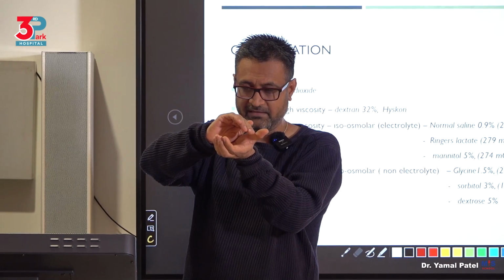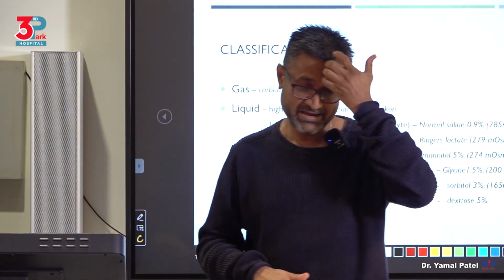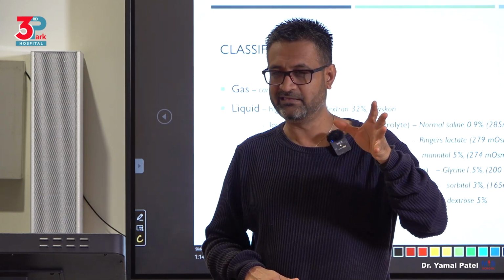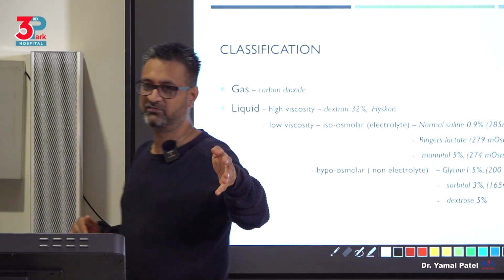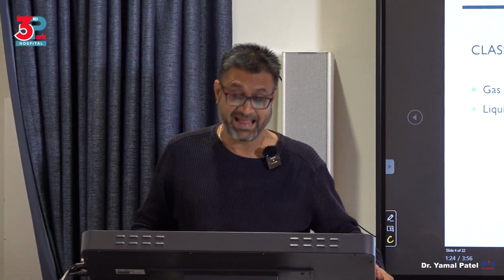You get what I'm saying? You can see it, but it's difficult to operate in because when you cut, the blood may not mix with it, and that liquid is not easily drained out. So it will remain there, with the blood and all the tissue. And the risks of hyperosmolar solutions have to be kept in mind.